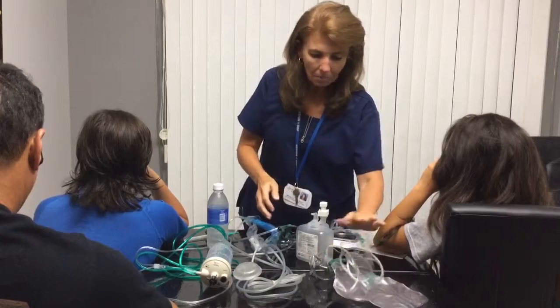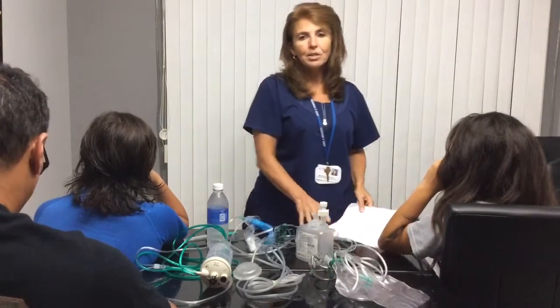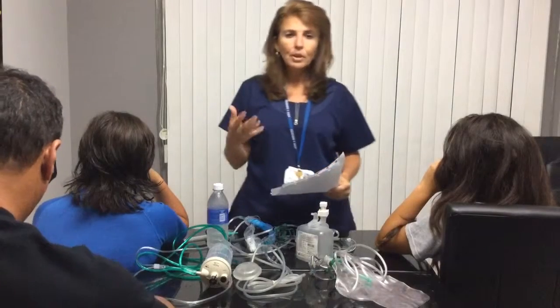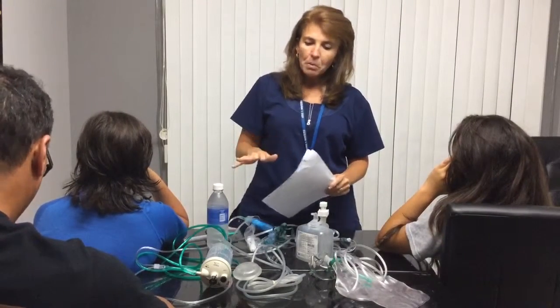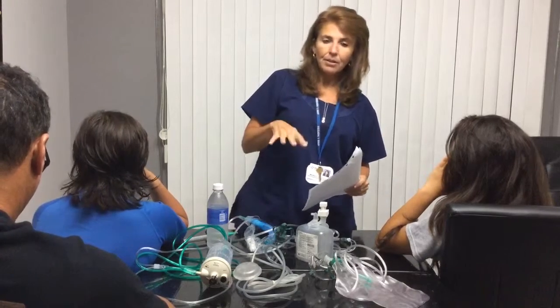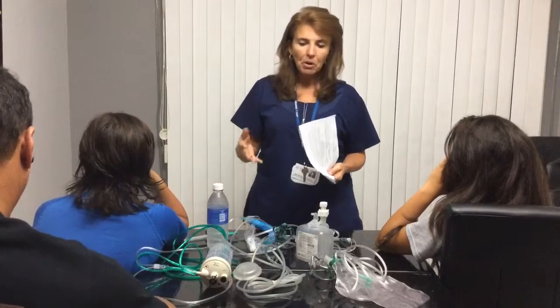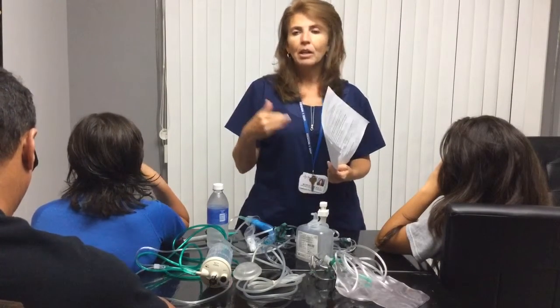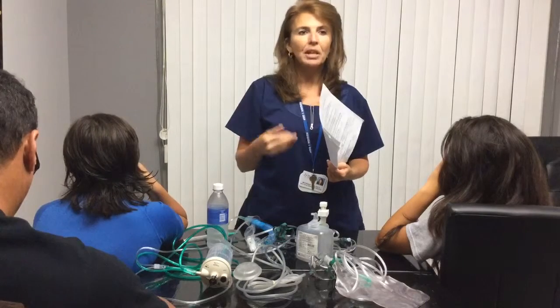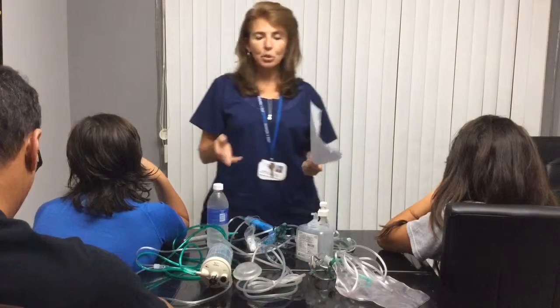Aside from our basic oxygen therapy, there are some safety considerations to be knowledgeable about. And basically, not so much in the home healthcare setting here in the hospital, but at home, patients that are going to go home on oxygen, we have to make sure that they're well educated regarding not cooking, not being exposed to any flames, any smoking, any sparks with electric devices or razors.